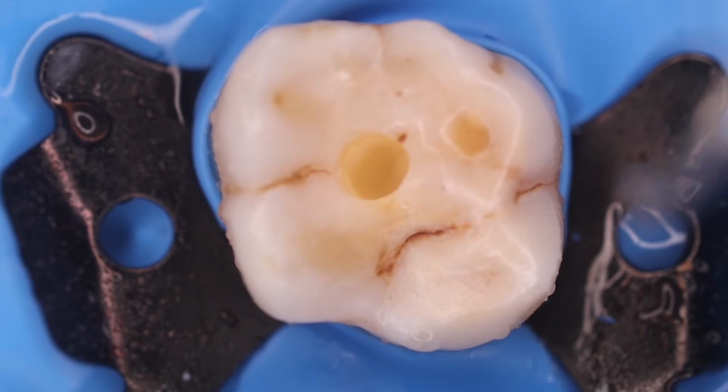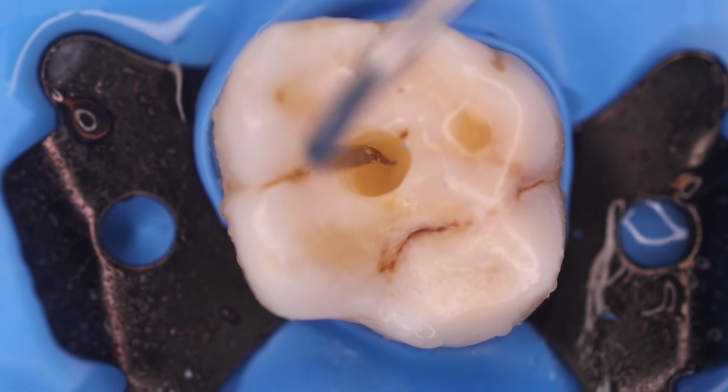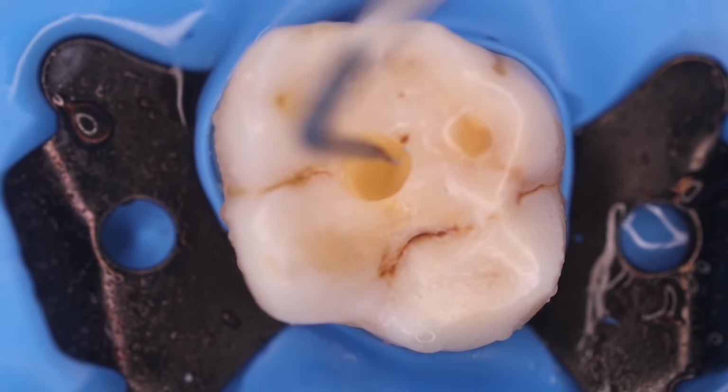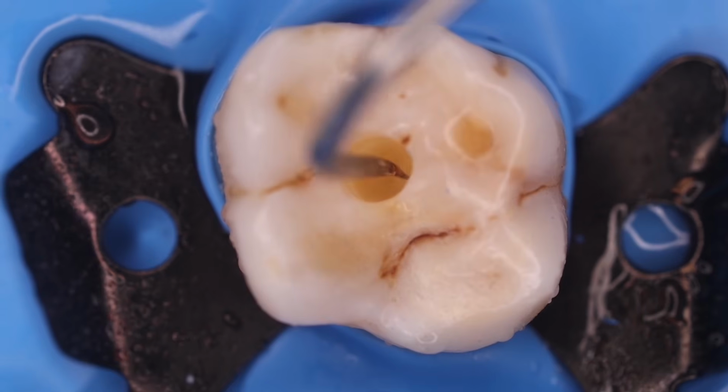Now appreciate the depth that we have already achieved. We are into the dentine and approaching the roof of the pulp chamber, and we are at the middle of the tooth, that is, at the center of the tooth.